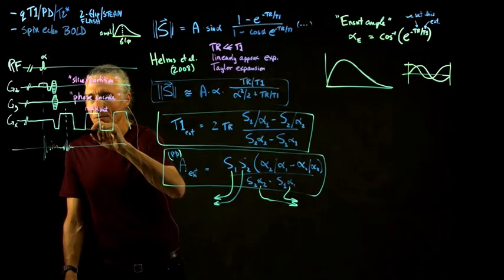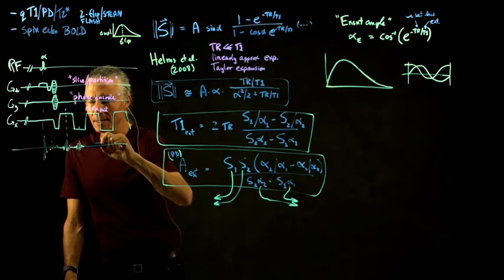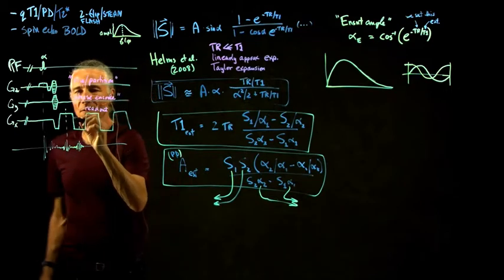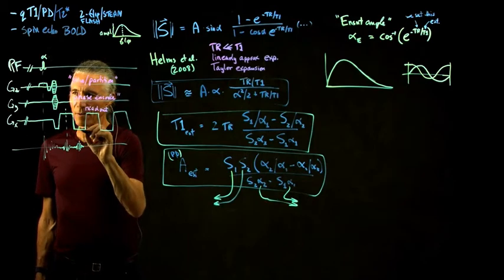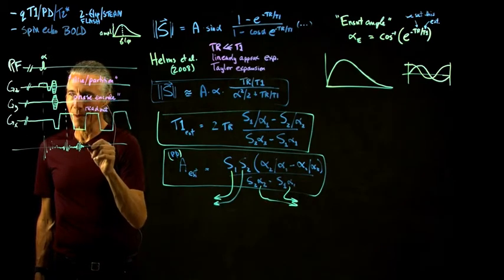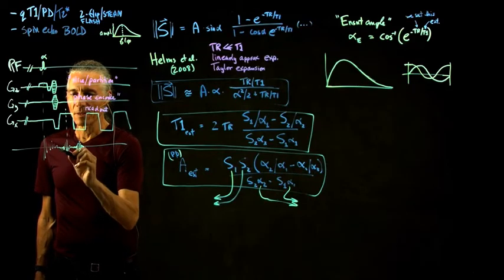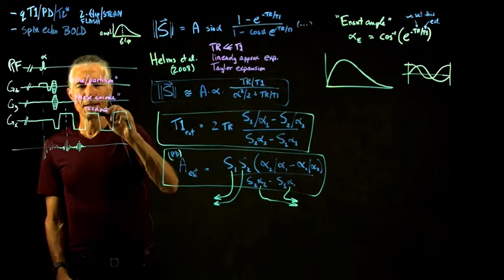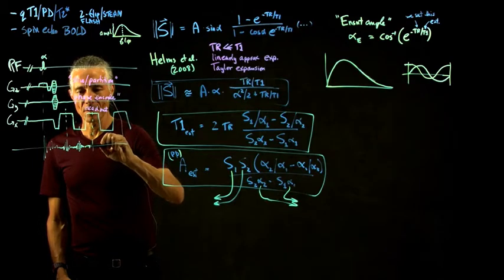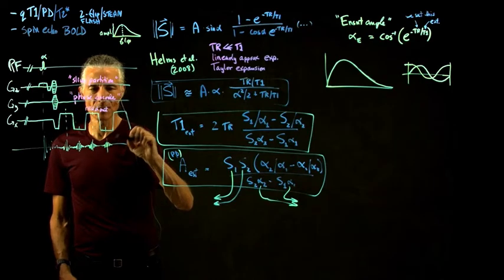And if you leave the gradient on, you will go back across k-space. So this sudden change in the gradient will essentially start unwrapping you the other way. This echo will be backwards like EPI. So you will have been at minus 128 and then plus 128, then plus 128 to minus 128, and then minus 128 to plus 128. You can do that a bunch of times and get a whole bunch of echoes.